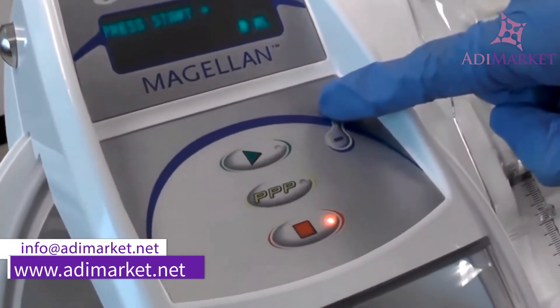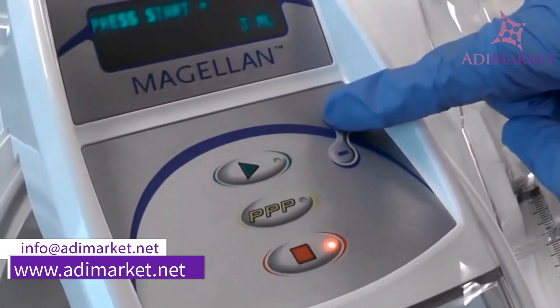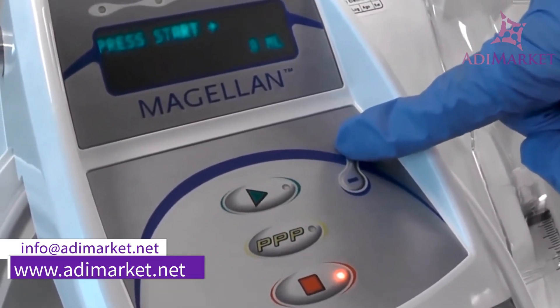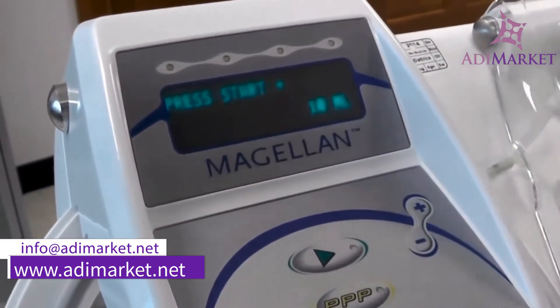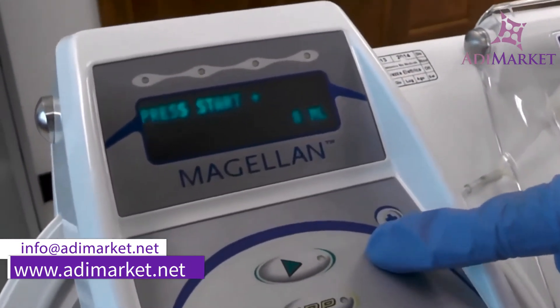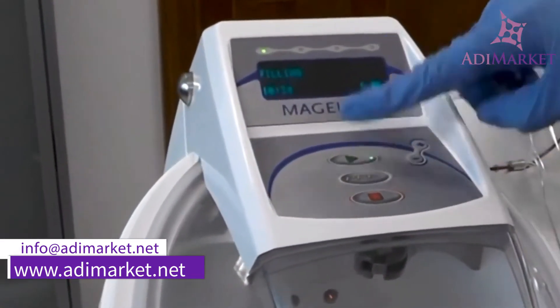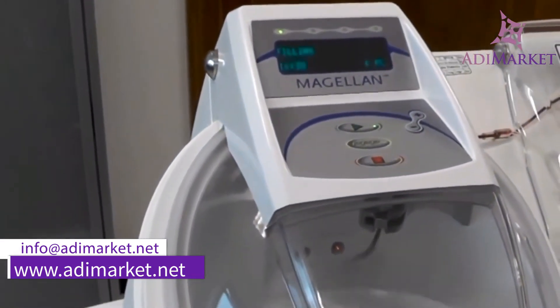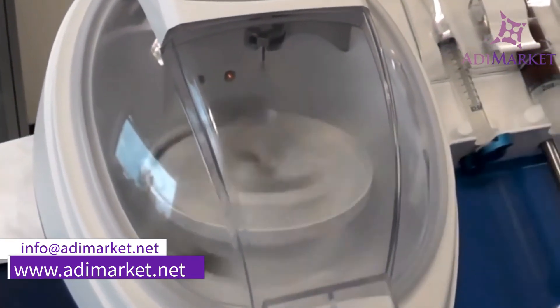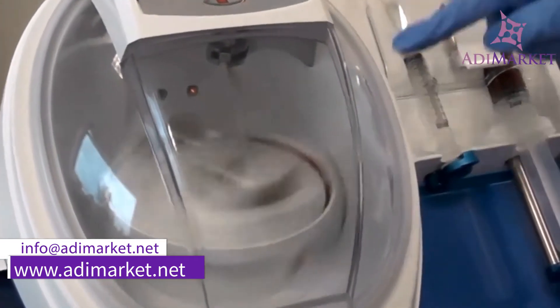You can use the plus and minus buttons to select your concentration or your finished volume. You can choose anywhere from 3 to 10 mLs depending on your desired concentration. For this spin, I'll select 6 mL. After we hit start, our auto spin will start its process. At this stage, the auto spin is spinning at 1000 RPMs while it's loading your whole blood into the disposable.